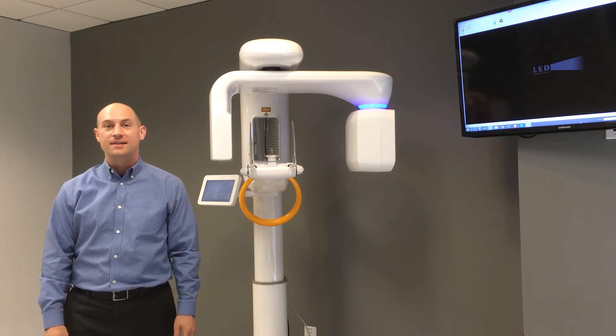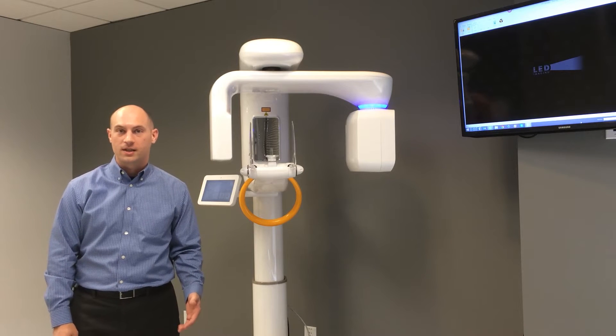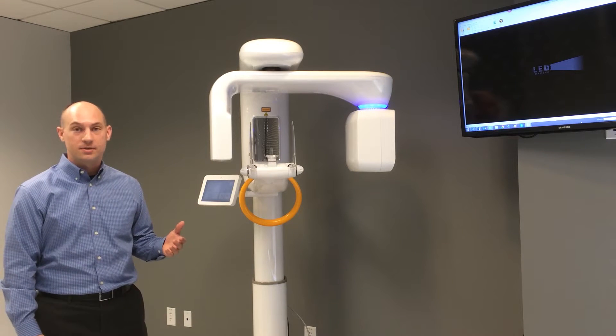Hi, I'm Wes Newsome with LED Dental, and today we're going to cover some of the hardware components of the RayScan Alpha Expert Pan and Cone Beam CT machine.